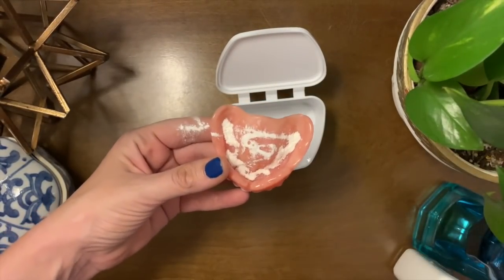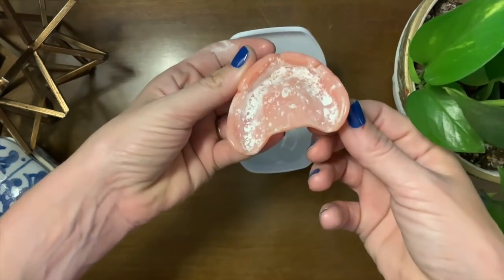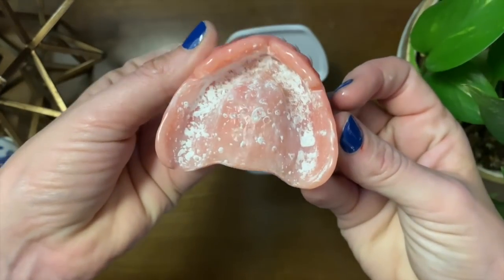Do this over the sink. You just put a little in there, then tap the excess off, and it will coat the top of your denture. You pop it right in your mouth and it will hold pretty much all day.